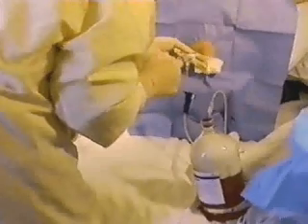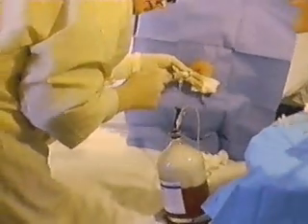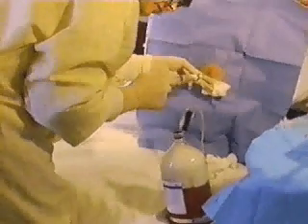One disadvantage of the needle-only procedure is that you must manually stabilize the needle throughout the fluid collection. Remember to order a follow-up chest x-ray to check for a pneumothorax.